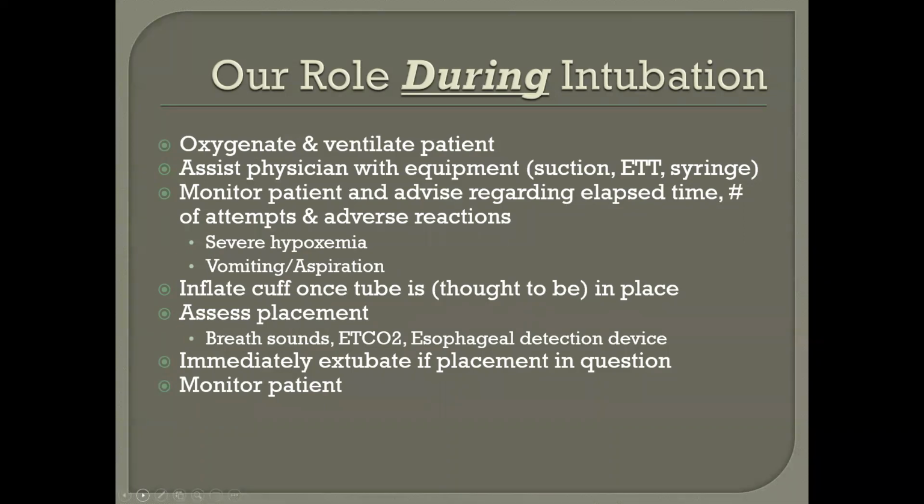The tube's in, but you're not getting either waveform capnography or color change. Advise the team very promptly. That will happen invariably, but it's a matter of identifying it quickly, because if the tube is in the patient's esophagus, they're not getting ventilated or oxygenated. The second related issue is that if it is in the esophagus and you put enough air in anyone's belly, they're going to vomit. And then you have another complexity superimposed on top of it.